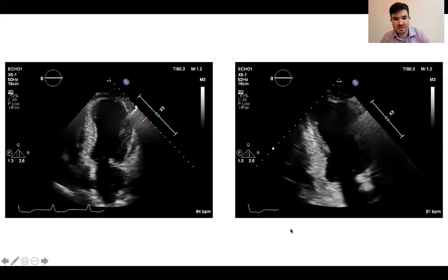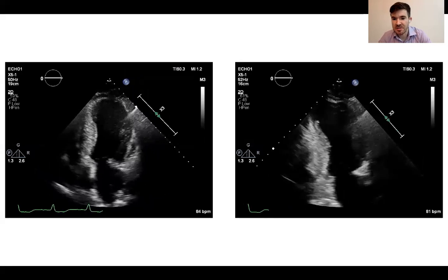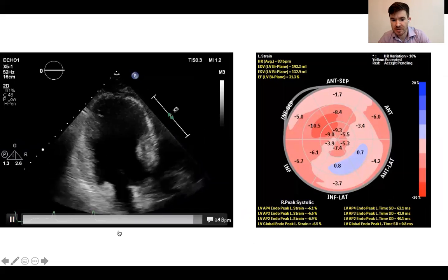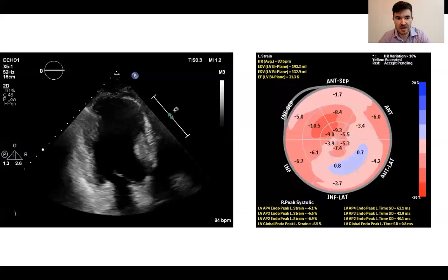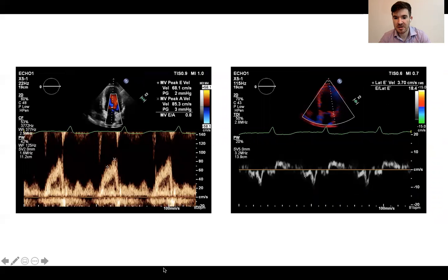And really quite an impressive abnormal regional wall motion abnormalities with his akinetic apex, which matches the PET and the MRI findings of no uptake, but really just scar in that area. And again, his global longitudinal strain was very much reduced at -6.5, and patchy reduction really in his case reflecting his akinetic apex. And again, as you'd expect, very low E prime values.